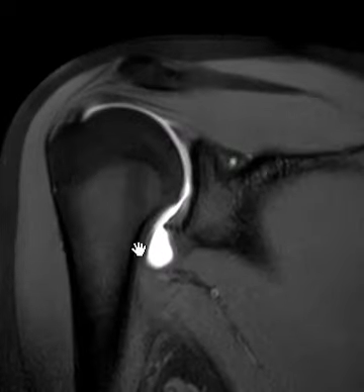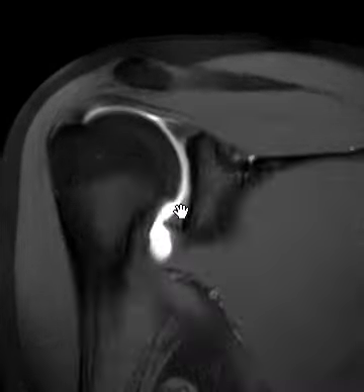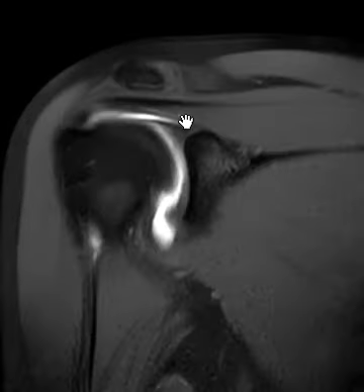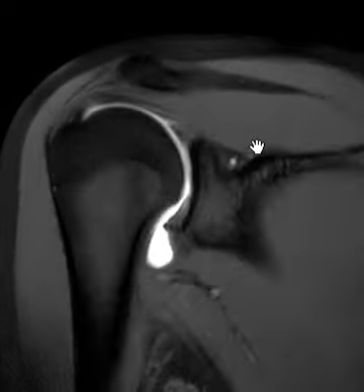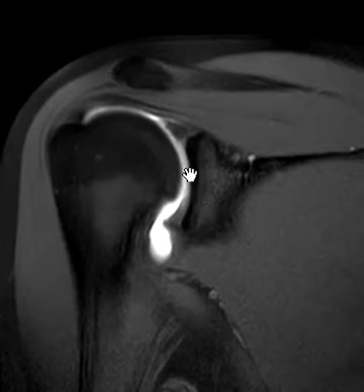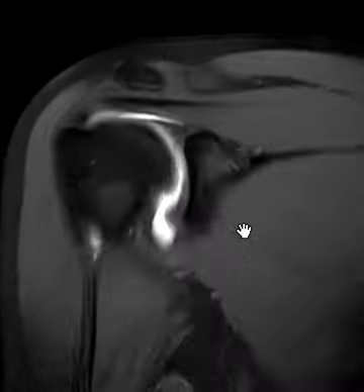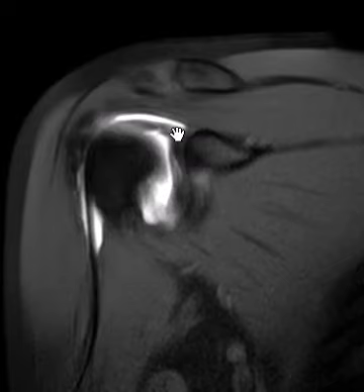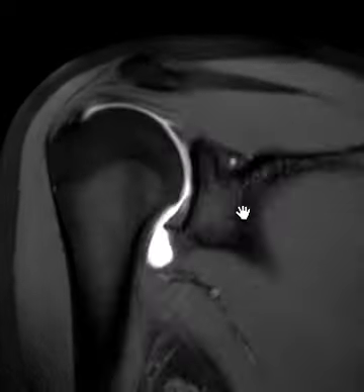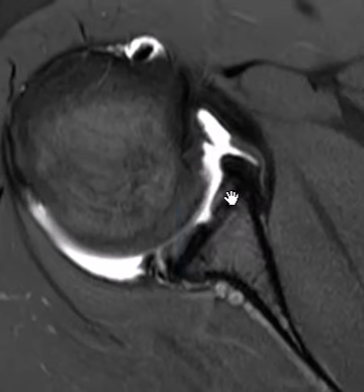We did an MRI arthrogram here. You can see fluid in the joint. If we go towards the top, the rotator cuff looks good. If we go towards the back, things look good, except on this slide something does not look normal back here along the back of the glenoid. The superior and inferior labrum look good. If we go anteriorly, things look pretty good. Here's a biceps labral anchor looking pretty good. So we're going to look at this abnormal signal in the back and put up an axial image.